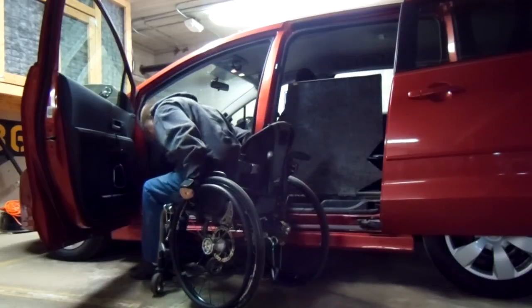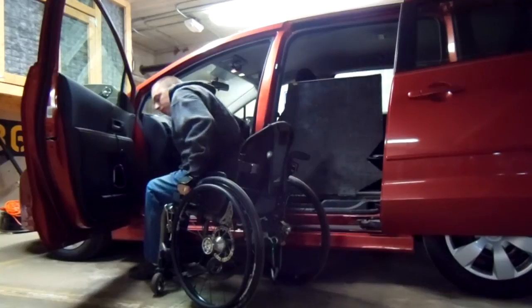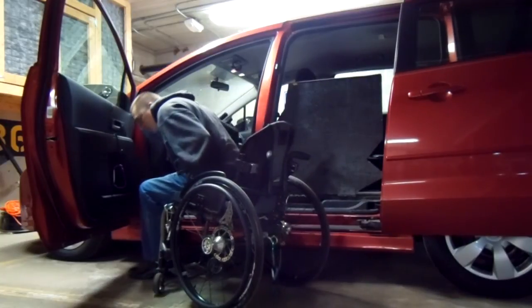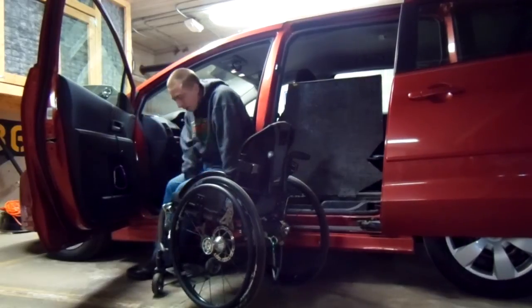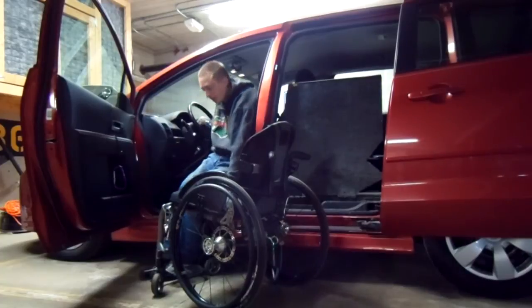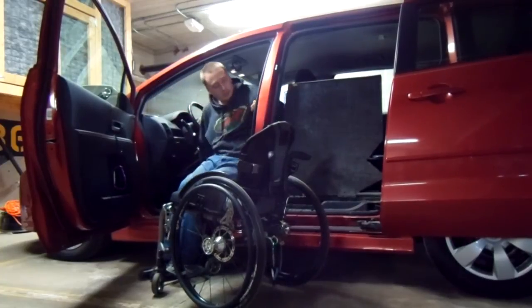The nice thing about the Mazda 5 is the seat height — it's about 5 inches lower than my Pontiac Montana van was, pretty similar to the other mediums. It's a pretty level transfer. I use the chair to support my weight, then I just scoot forward.